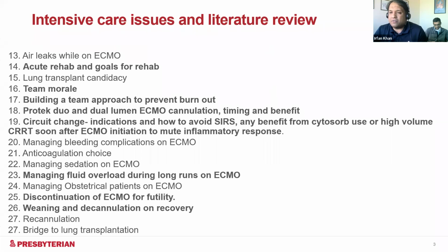The other centers that I've talked to have used high volume CRRT, and that is early on in the course. As soon as you cannulate for ECMO, these patients go on for a couple of days of high volume CRRT, mainly to remove the cytokine response. So that's something they've had great success with. We haven't personally explored it except for one patient who had a great outcome.